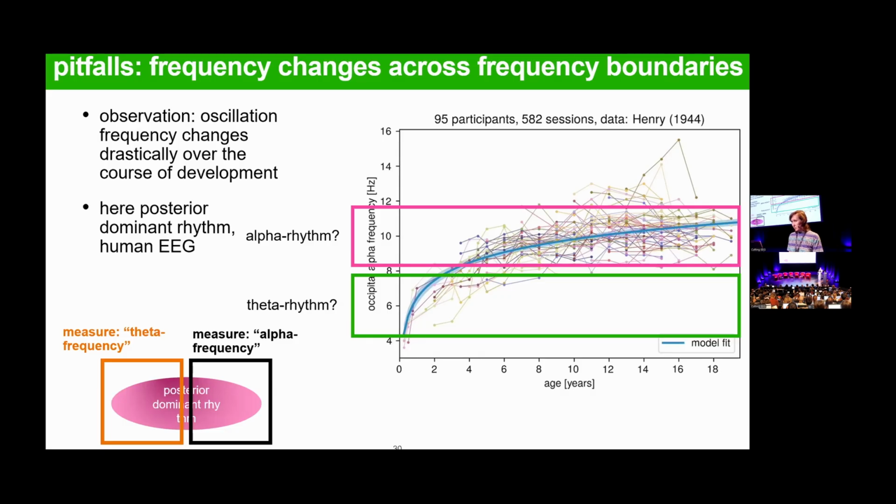We can compute things from our EEG data with a toolbox super conveniently, but we have to really make sure that we are measuring what we intend to measure.